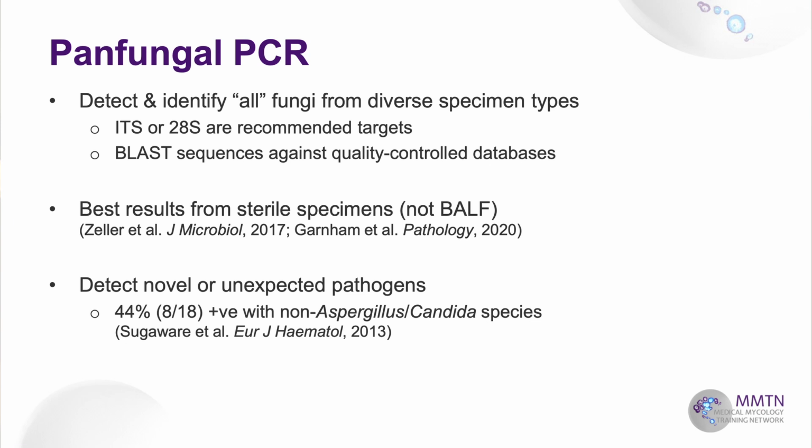The best results with this type of approach are from sterile site specimens, not BAL fluid, and I'll touch on that later. Early studies found that it actually has the ability to detect novel or unexpected pathogens. So this study from 2013 found that 44% of the samples were actually positive for non-Aspergillus and non-Candida. So they're positive for things like Fusarium, Scedosporium.